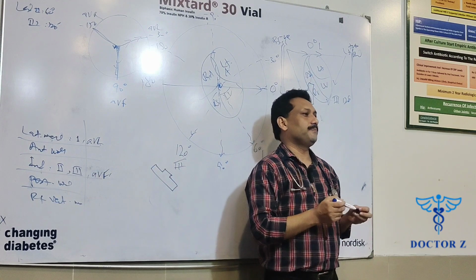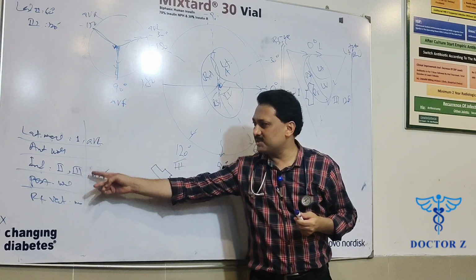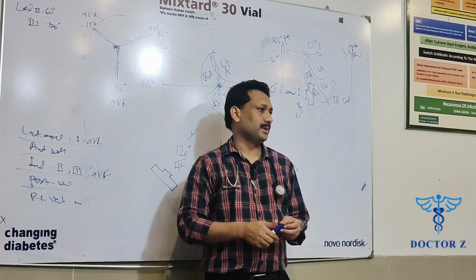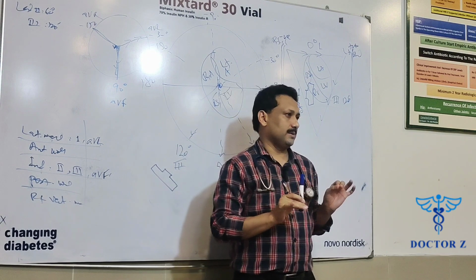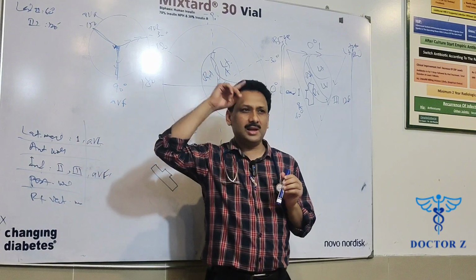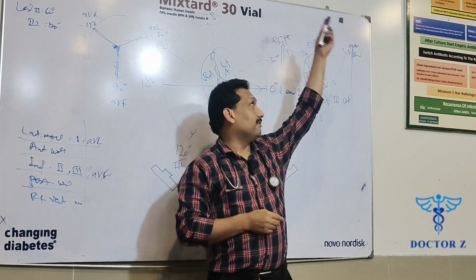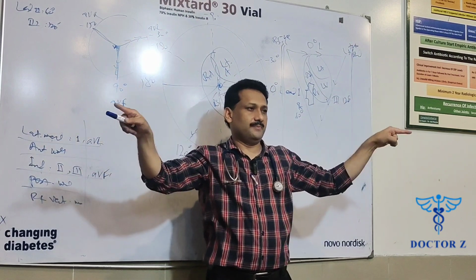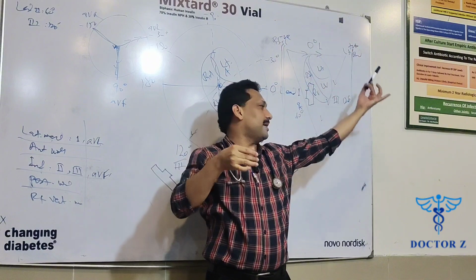Up till that point, we already know a lot about the lateral wall and inferior wall, but the biggest wall of the heart is still there. So what to do for that anterior wall? Up till now, we were basically placing the leads in vertical dimensions. One camera here, one camera here, one here, one here. So if you make a circle, these are the directions in which these cameras are placed.